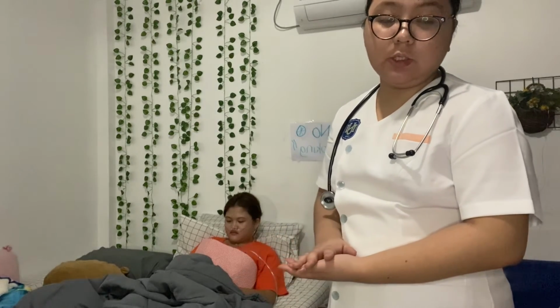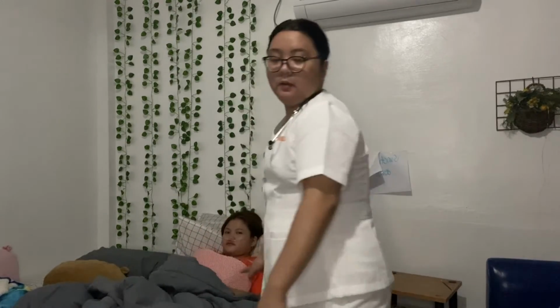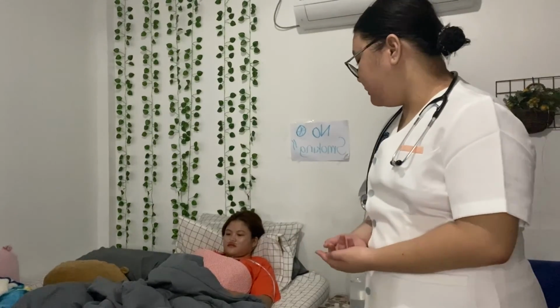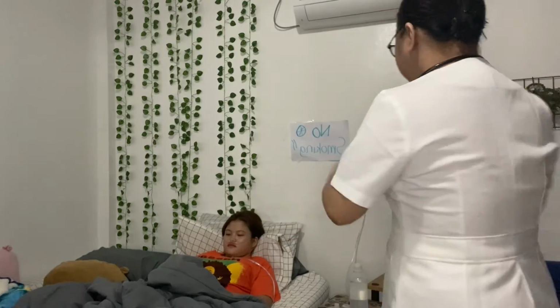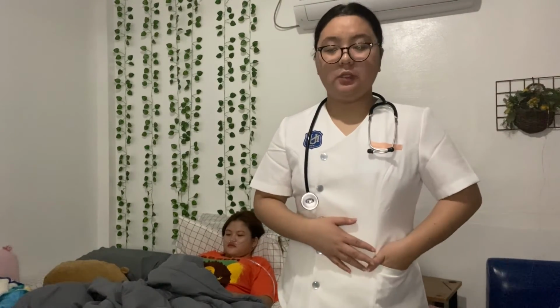And I'm going to reposition the patient. Pwede po ba kayong umayos ng pwesto para maging comfortable kayo? And then, after that, remove the towel and discard the remainder of NSS into appropriate receptacle and wash hands. So I'm going to remove the towel and I'm going to also wash my hands. Already done. So that's it for the suctioning.